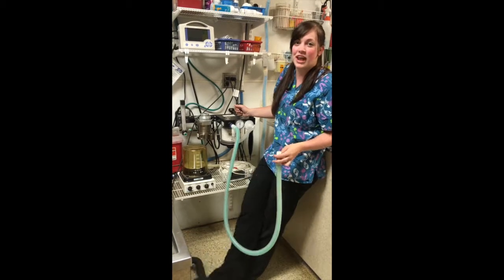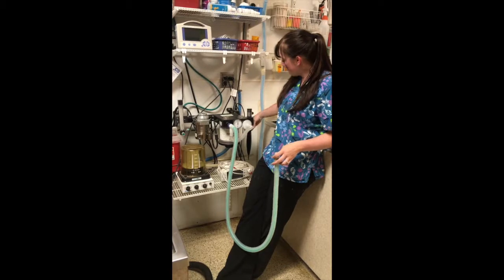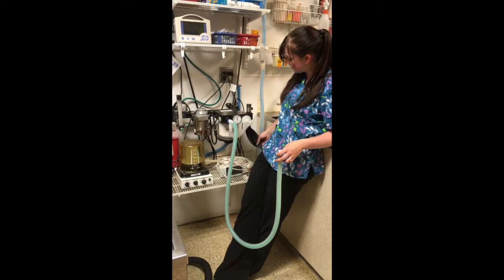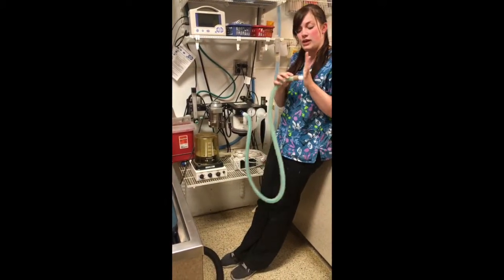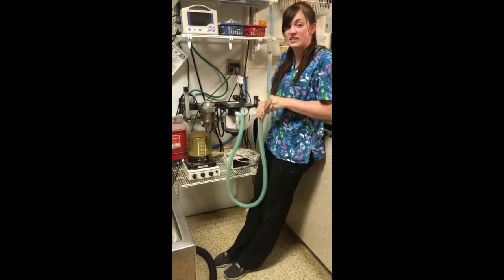Alright, I'm going to be demonstrating how to do a leak test on an anesthetic machine. So I have our machine here. I've taken the scavenging tubing off, so I have a reservoir bag hooked up. Pop-off valve is closed. So what I'm going to do is take my tube and firmly press it in my palm, creating a really tight seal.